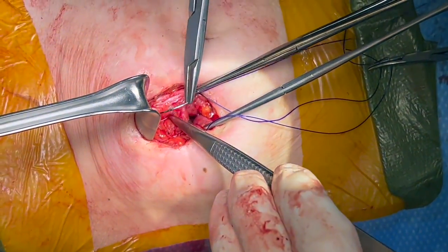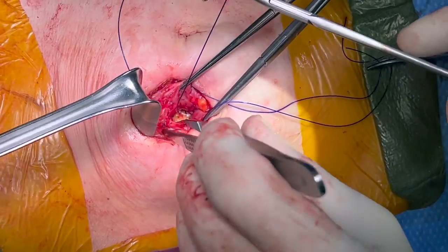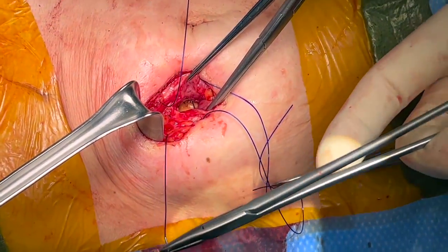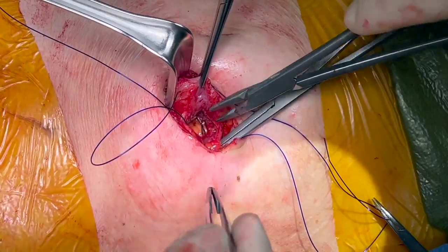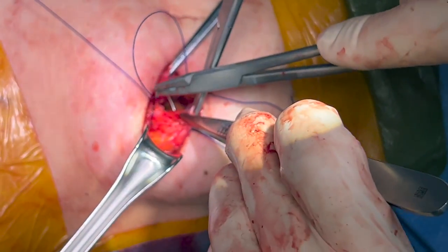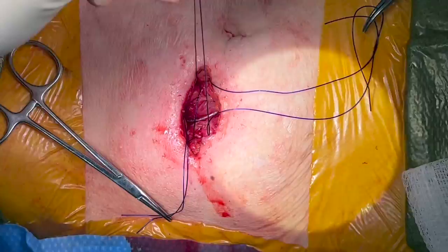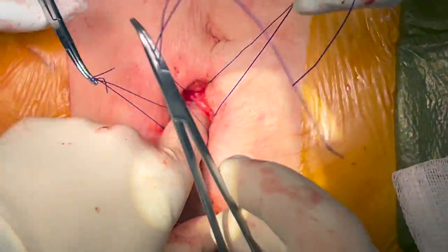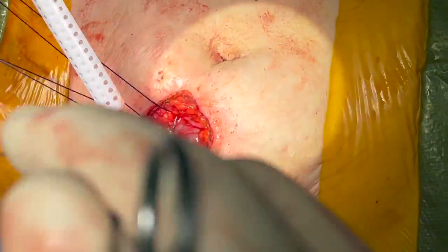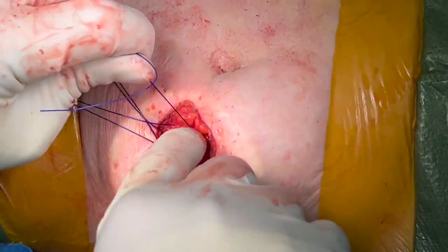The fascia is closed in an interrupted or running fashion using a slowly absorbable monofilament suture. In this case, we close the fascial defect in 3-fold thickness figure-of-eight stitches. Before tying the fascial stitches, a final inspection can help prevent entrapment of intra-abdominal contents in the sutures. The sutures are tied down in a slipknot and pushed down until the suture is tied.